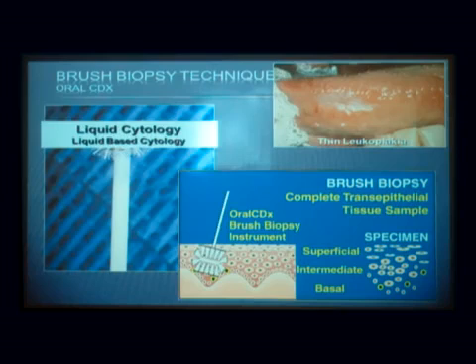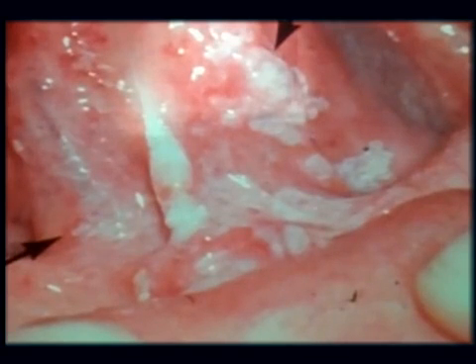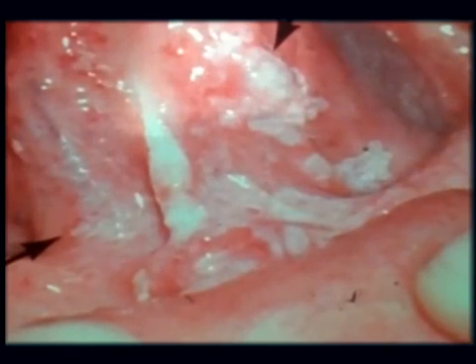Would that work on something like this? Not if you don't know the lesions. If you don't know that progression from left to right that I told you about, you might spin that brush right here instead of over here, or maybe over here. Or you wouldn't go into those rough surface areas. It really isn't made for a lesion that is obvious enough. It's made for those sort of iffy lesions like the thin leukoplakias.